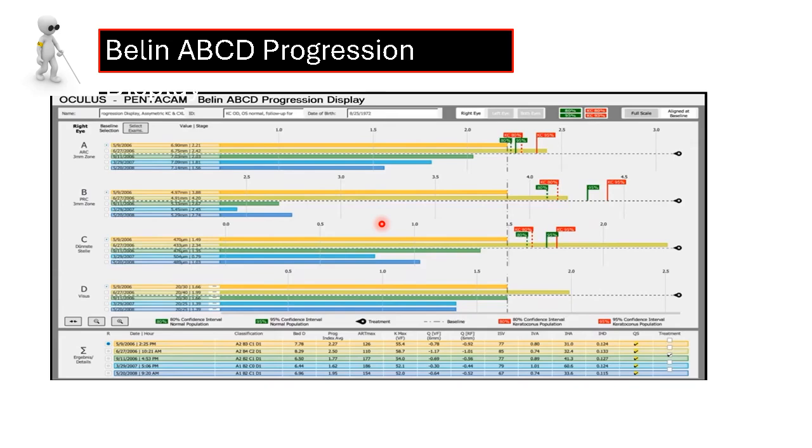Another thing that the progression analysis should take into consideration is other variables like the age of the patient. Now, even mild changes in a young patient as compared to a normal population should be taken seriously, because there might be a rapid progression in his ectasia, and the risk will be very high. Unlike if we take the same progression or changes in the cornea in an old patient, the risk is less. So although the same changes happen as far as the anterior or posterior surface of the cornea, the age variable differs and we need to take urgent action based on his age.